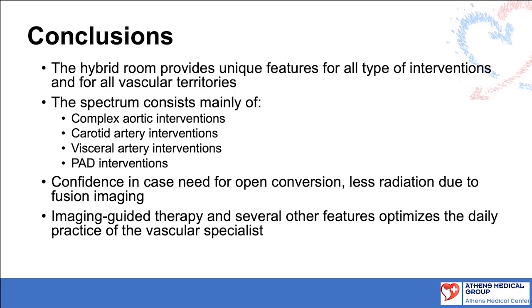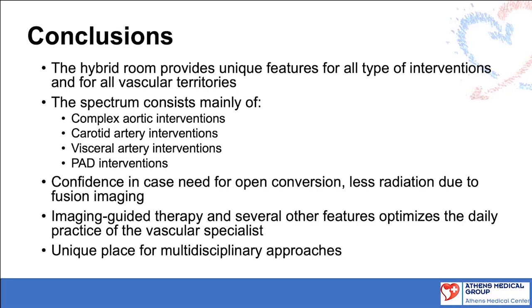Imaging-guided therapy, due to the fact that we have not only the hybrid room, but all these features that GE provides, from ultrasound up to the CT scan, and several other features optimizing the daily practice of the vascular specialist. And it is a unique place for multidisciplinary approaches, like in cases of coexistence of cardiac and vascular surgeons, or even in case of embolization of tumors between general surgeons and vascular specialists.